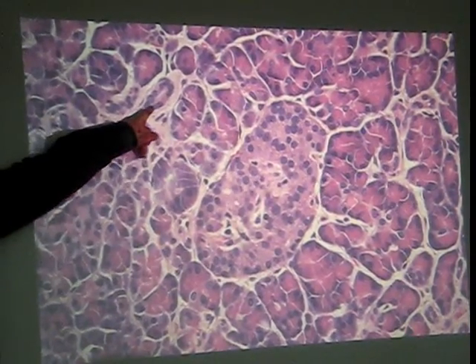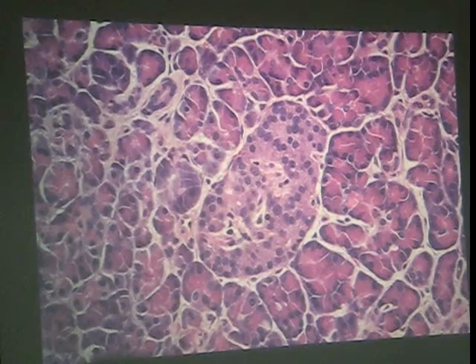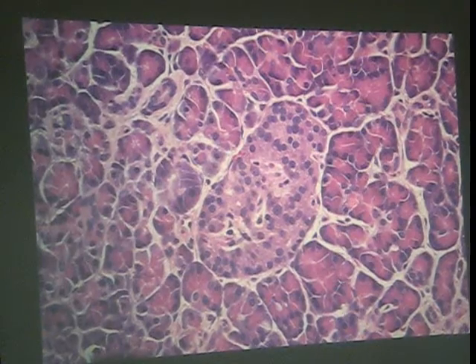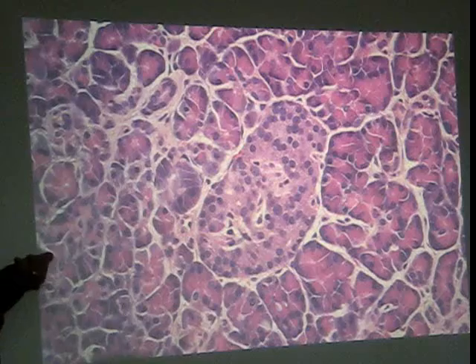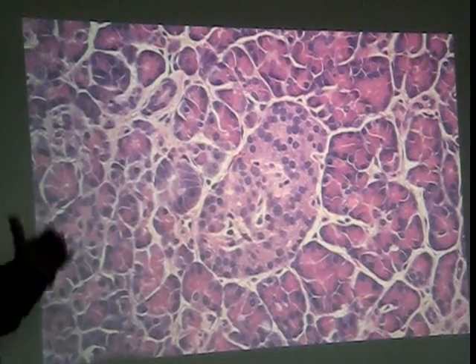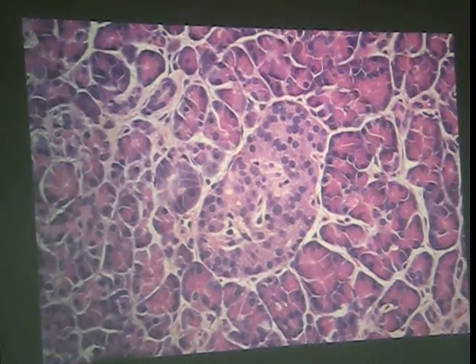What's this right here? Capillary? It's tubular, I'll give you that. If it's capillary, what kind of epithelium should we be looking at? What kind of epithelium is that? Cuboidal. It's probably an intercalated duct. Remember, you have the centroacinar cells, which lead into the smallest ducts, the intercalated ducts, which drain into the intralobular ducts.